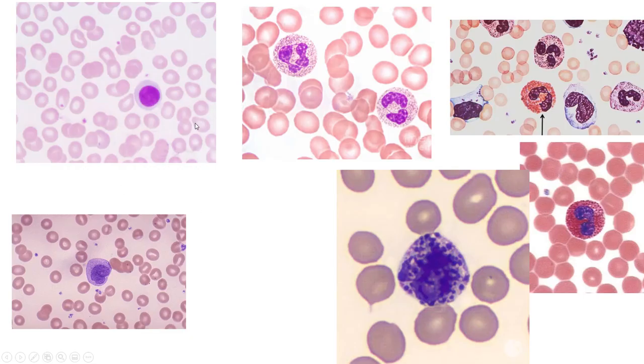So these are all our leukocytes that I wanted to just review. So here, the lymphocyte. These two multilobed nuclei would be neutrophils. Coming over here, this one with the reddish/orange color would be an eosinophil. Here's another eosinophil. Notice the different color. And here's a basophil. Basophils are kind of large, with big granules that look spiky in appearance.